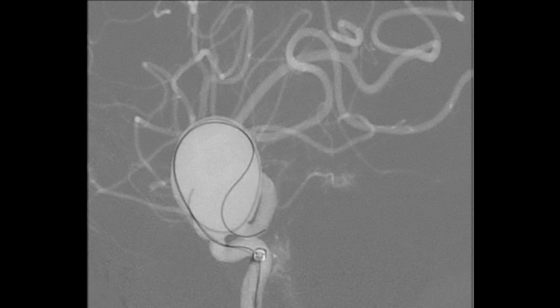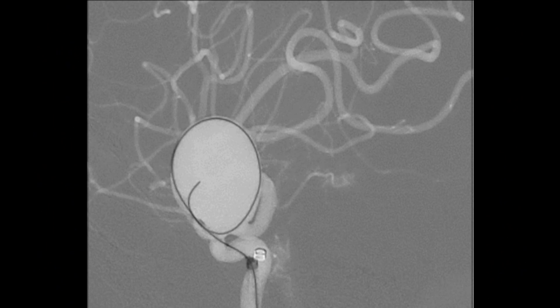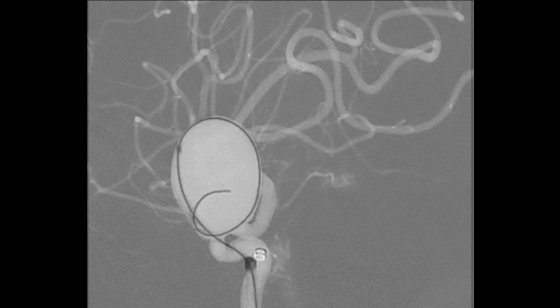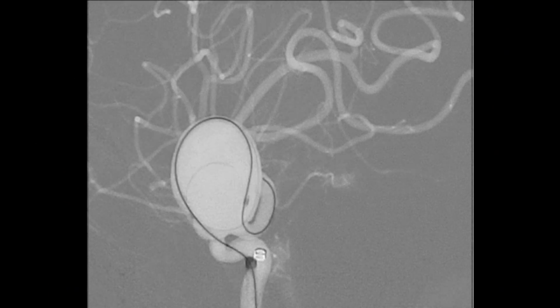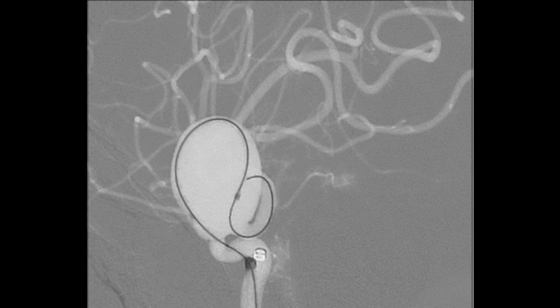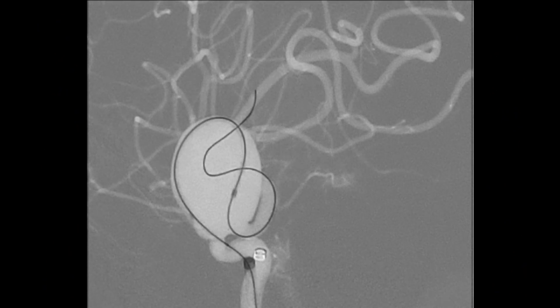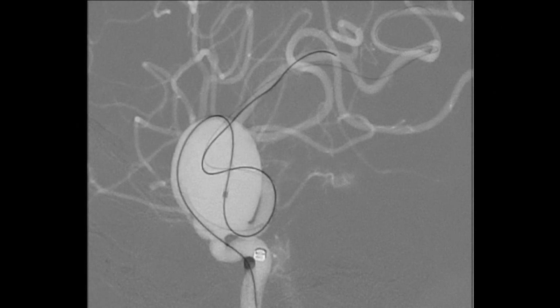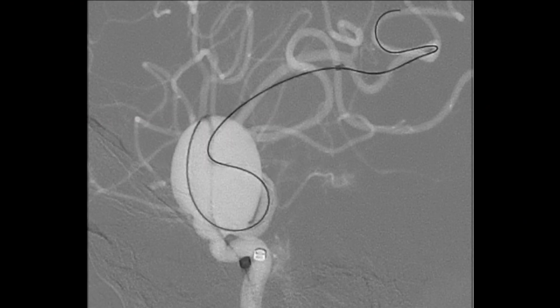So then the Marksman was taken along the wall of the aneurysm, and it pointed inferiorly. This helped us to hook it, and the wire now was stable enough for us to take it distally into the middle cerebral artery. The wire was sent very distally. Only when the hard part of the wire was in, we could navigate the Marksman very distally.